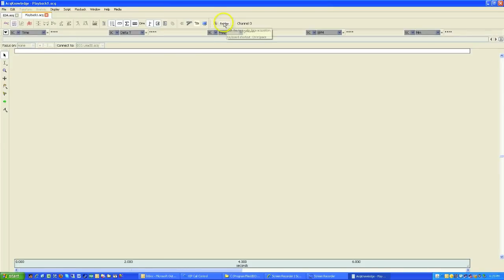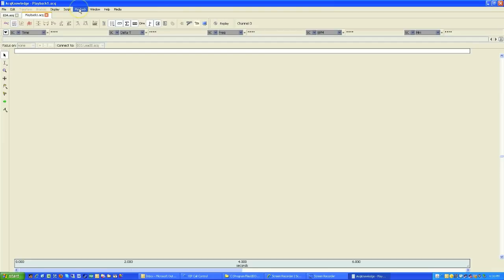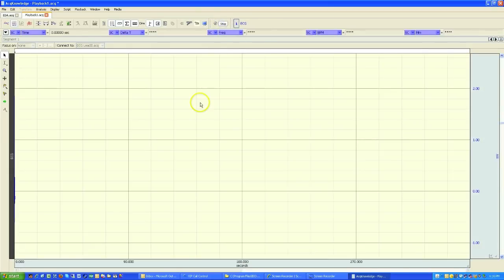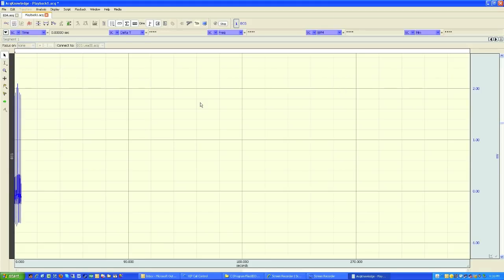And the Start button now becomes the Replay button. And the Hardware Device menu, which could have been MP100, MP36, MP150, now becomes Playback. And if I hit the Replay button, this is going to replay the data exactly as it was recorded.